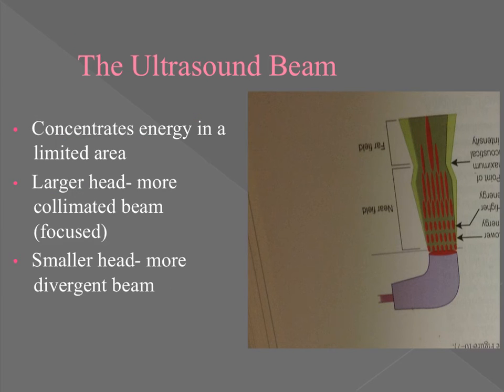Okay? All right. What we know about the ultrasound beam in general, and this is probably going deeper than you guys want to know, but I happen to think it's an important concept because you have to understand where ultrasonic energy is coming from, right? We have to get a good understanding of what ultrasonic energy actually looks like itself.